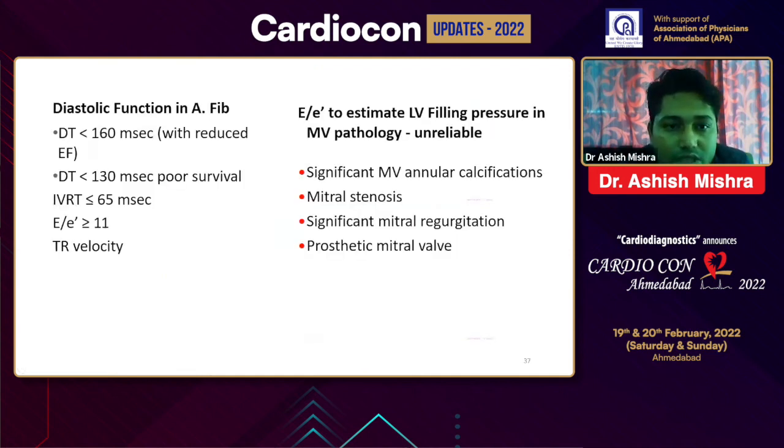Diastolic function assessment is particularly important also in the presence of atrial fibrillation. The parameters to be relied upon are particularly the deceleration time; if it is less than 160 milliseconds, it denotes LV diastolic dysfunction. Deceleration time less than 130 milliseconds denotes poor survival in most subjects. IVRT less than 65 milliseconds and E by E dash more than 11 are other parameters to be relied upon, particularly in atrial fibrillation patients.